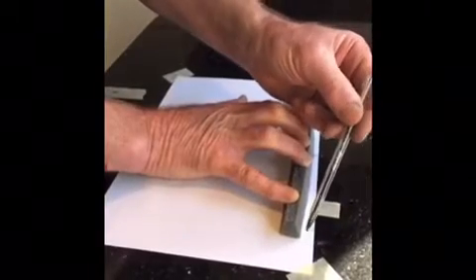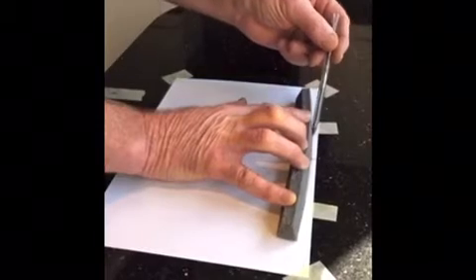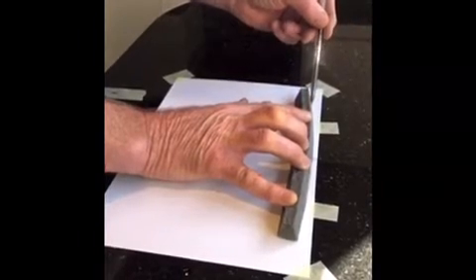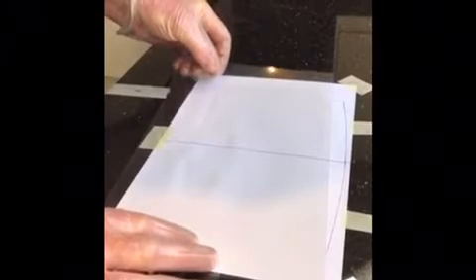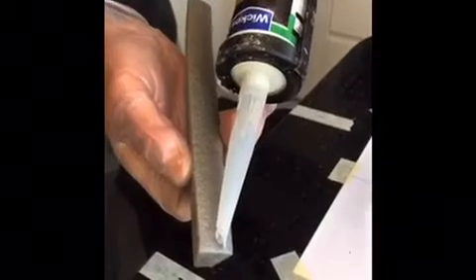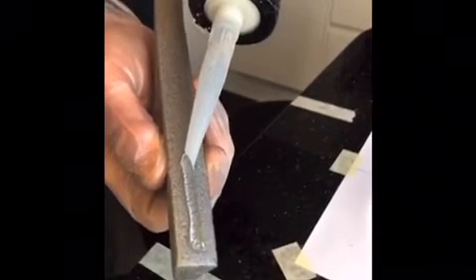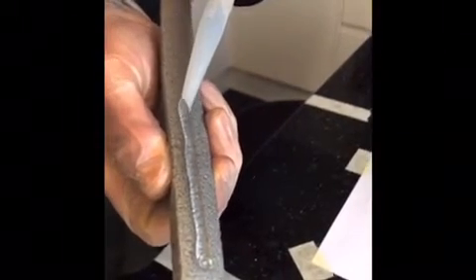Secure A4 piece of paper and mark out bend on A4 piece of paper. Put gloves on and line up OHP transparency on template. Apply instant grab adhesive along the whole of the piece of lagging.